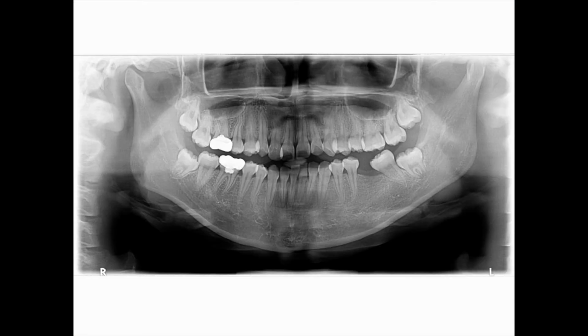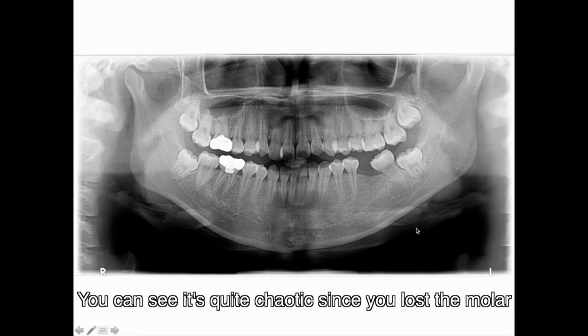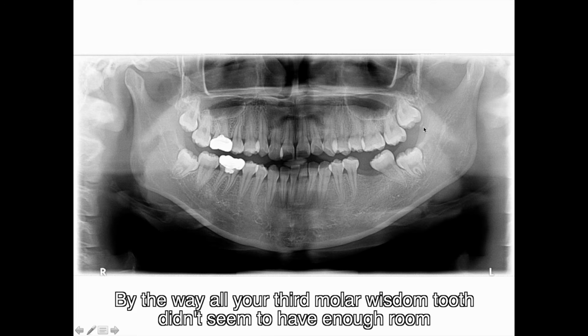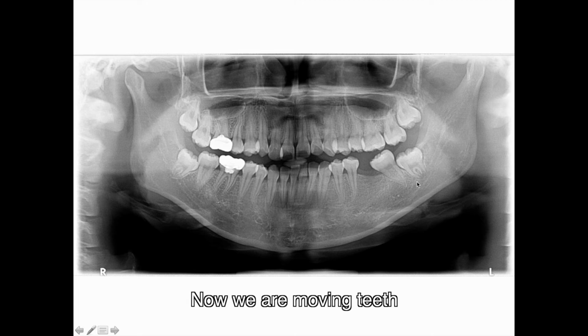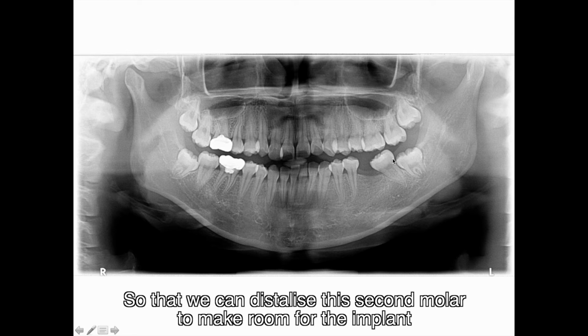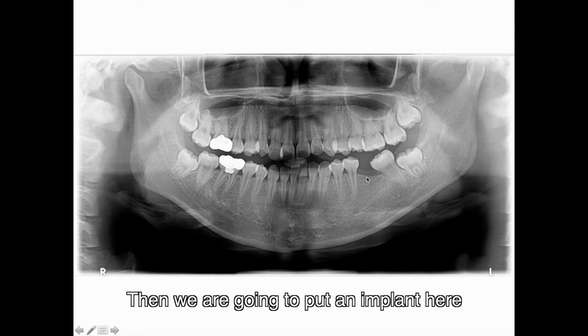Next. Okay, so you can see it's quite chaotic since you lost the molar. By the way, all your third molars, wisdom teeth, didn't seem to have enough room. They may need to come out in due course. Not now, in due course. Now we're moving teeth, but except the lower left third molar, maybe we have to extract this too, so that we can distalize this second molar to make room for the implant here. Okay, we're gonna put an implant here.